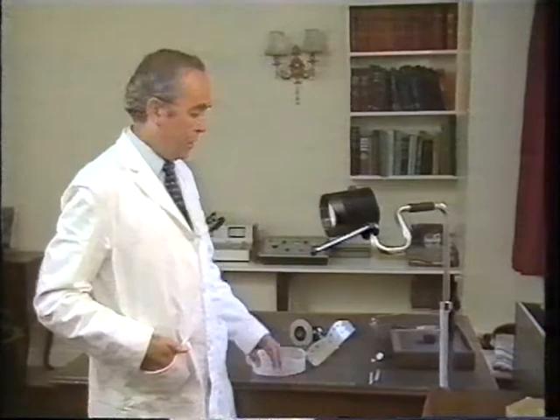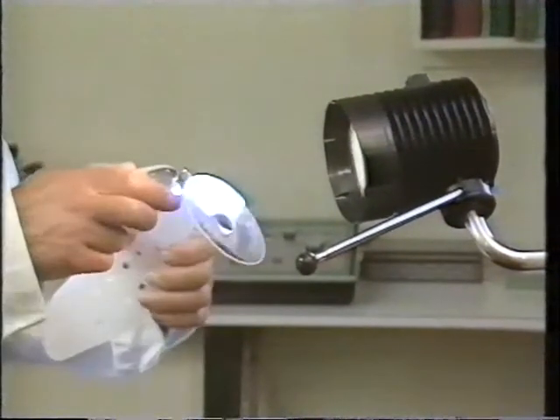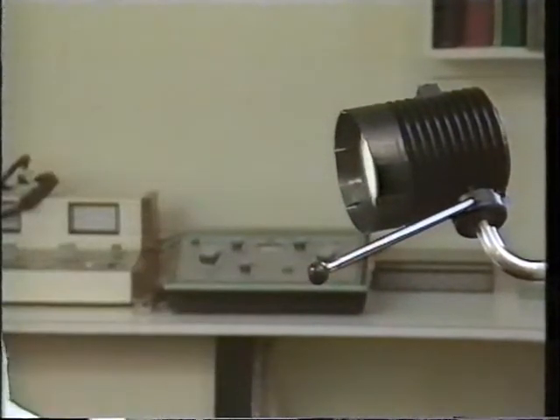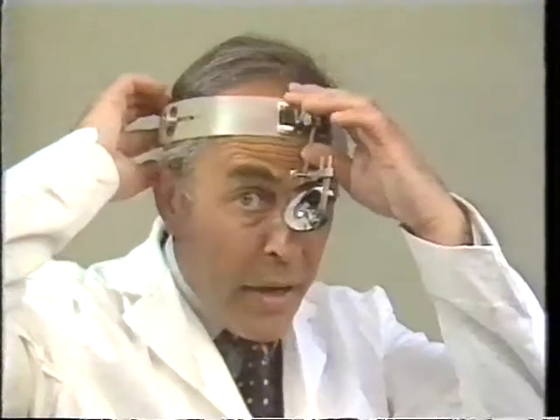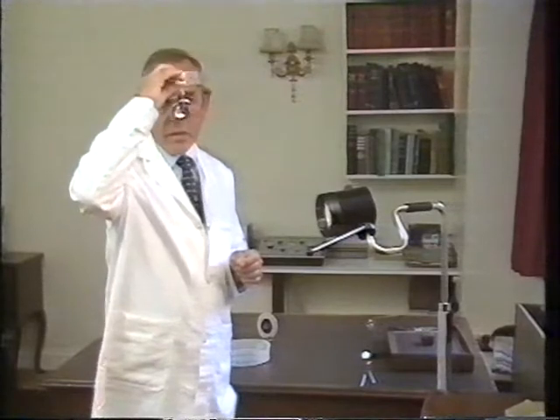Obviously, lighting is very important. This may be provided either by a traditional head mirror in association with a bulldog lamp, or by an electrically operated headlight. Now, either form, unlike an ordinary torch, illuminates coaxially with the line of vision, and both free the hands for manipulation of instruments.